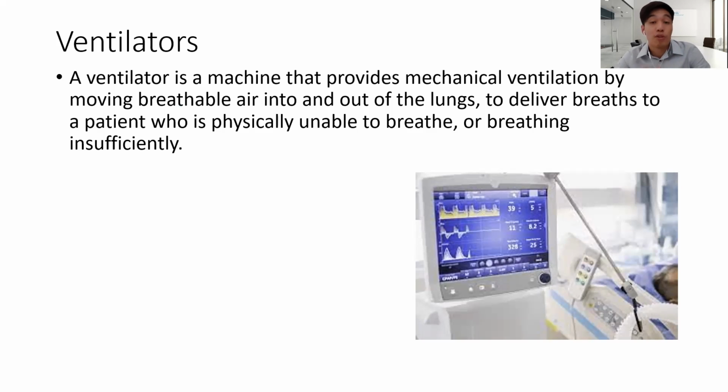It is able to take over for a patient who is unable to breathe by themselves, or is not breathing sufficiently. For example, COVID patients, or patients who are in a coma, so they're unable to breathe by themselves. So the ventilator will breathe for them.